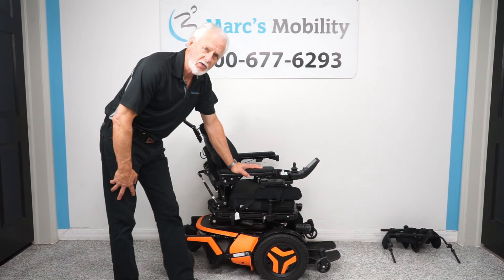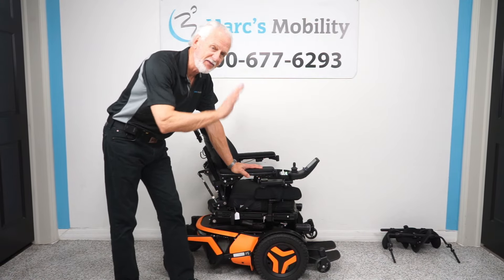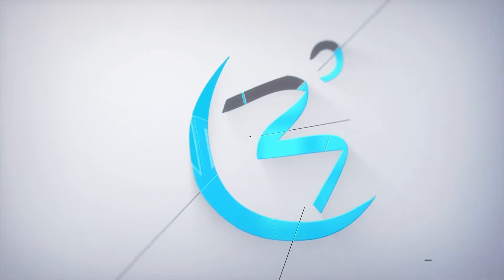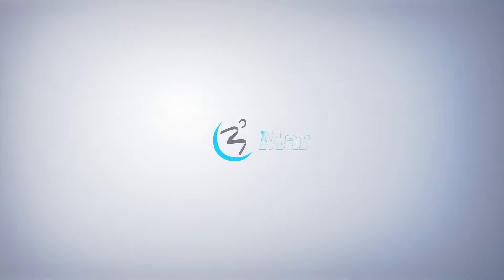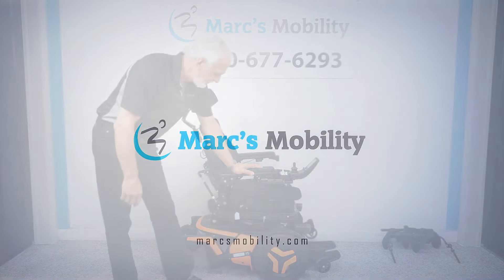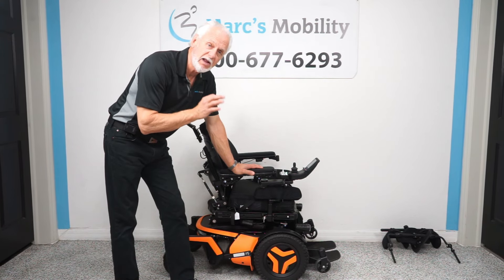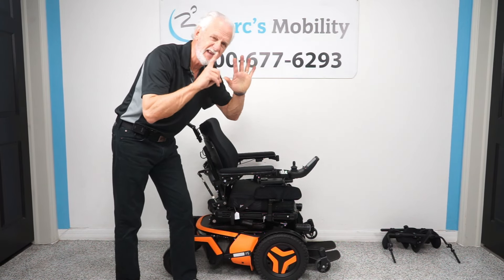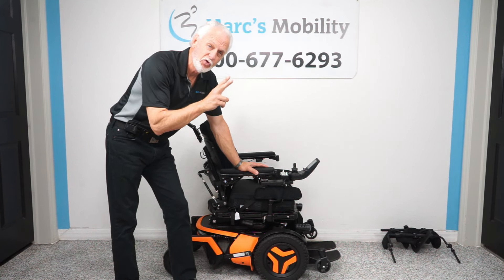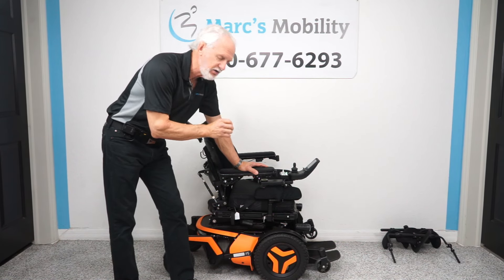Good morning, folks. This is Mark with Marc's Mobility. We're doing a video this morning on a Permobil F5 standing power chair with seven functions and 36 miles, used about a month and a half, two months. Literally brand new. This is one of the most engineered chairs in America.